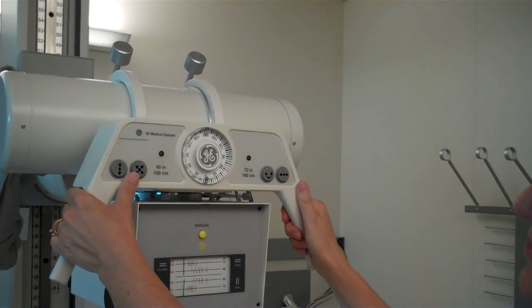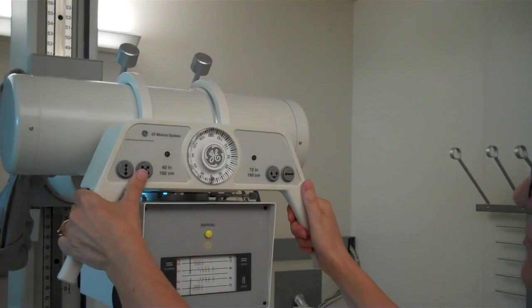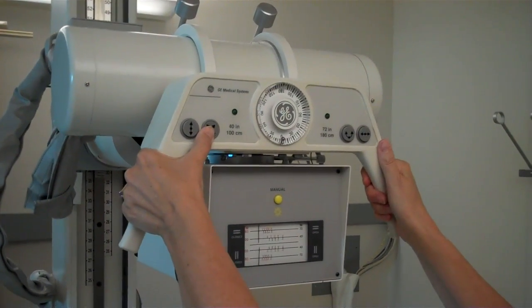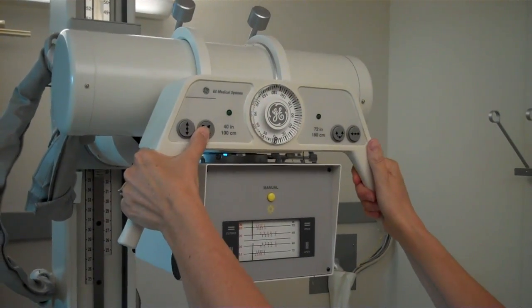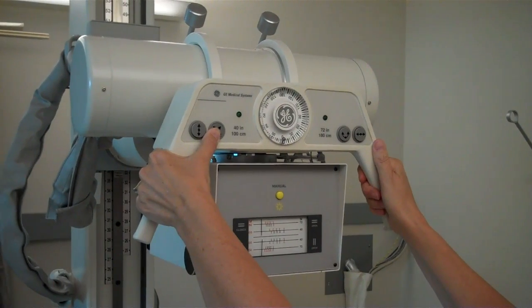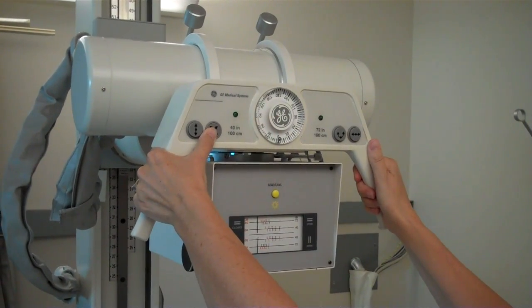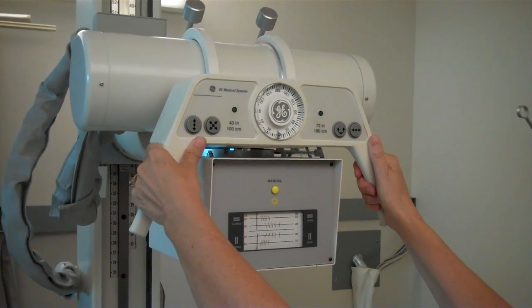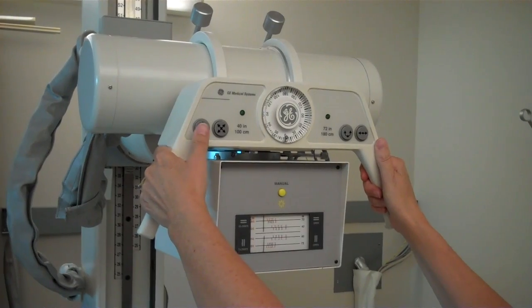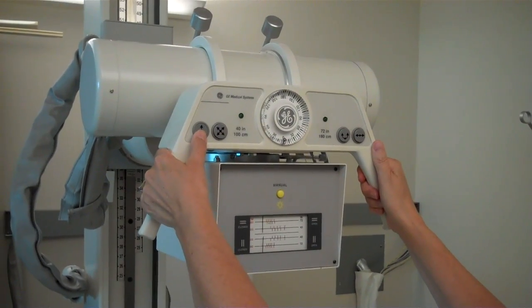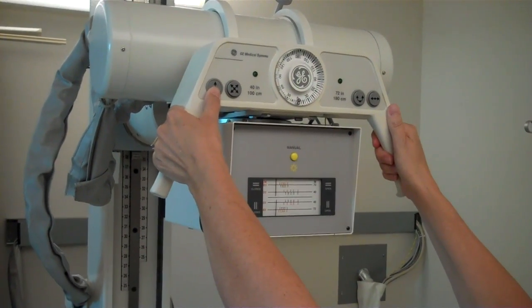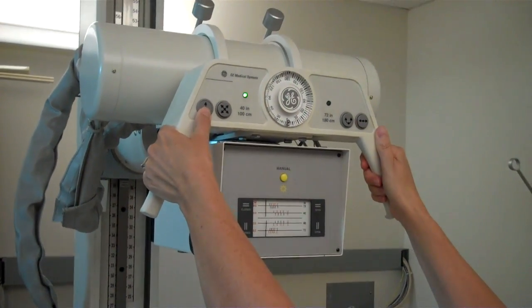For side to side movement, we must assure that the tube aligns with the bucky and you will feel when that falls into place. Then maintain your 40 inch SID.